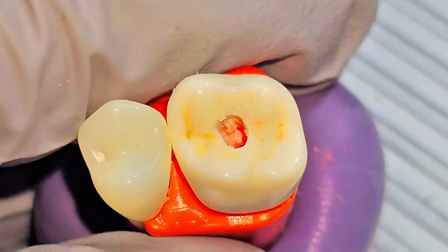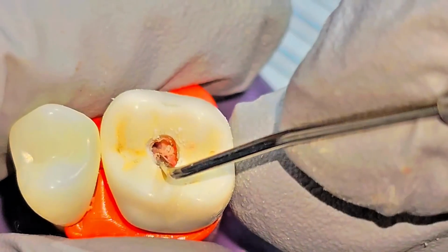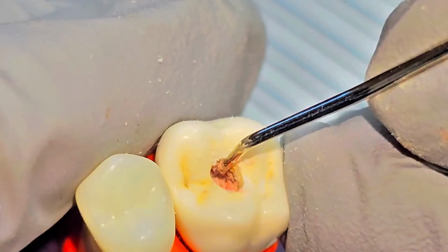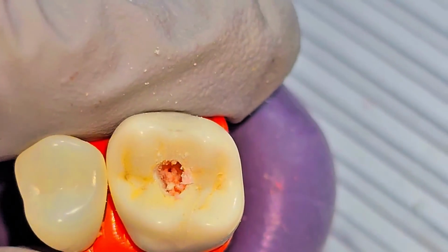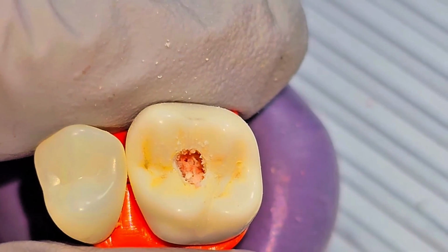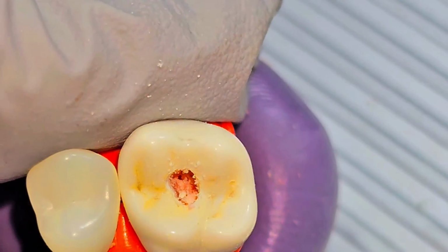Let's check with the endo explorer. Now it is much better, right? And also here a little bit more. It is still slightly slanted, and here it is good, but I'm gonna widen a little bit more. So, just mid-checking. From the ridge we still have ample room, 3 millimeter, and from the buccal side I have about 2 millimeter, and from the lingual I have 2 millimeter. Good.